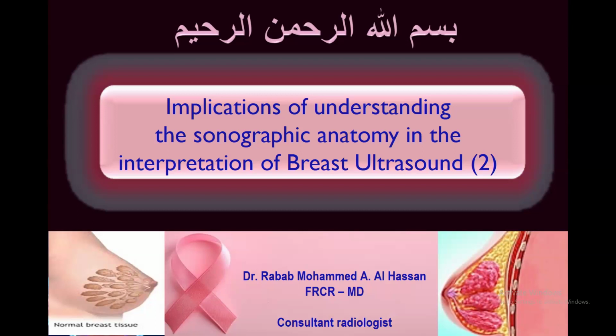Welcome everyone to our today's presentation. We are continuing sonographic anatomy of the breast. Our educational objectives are to review the basic breast anatomy, to discuss how anatomy influences the detection of breast abnormality, and to diagnose breast diseases and conditions.